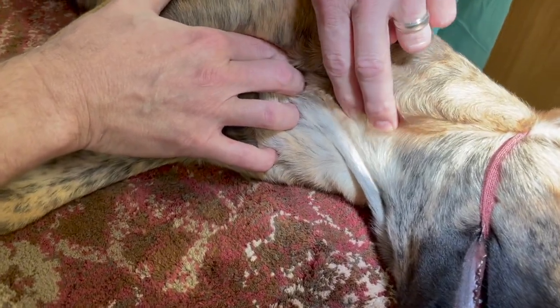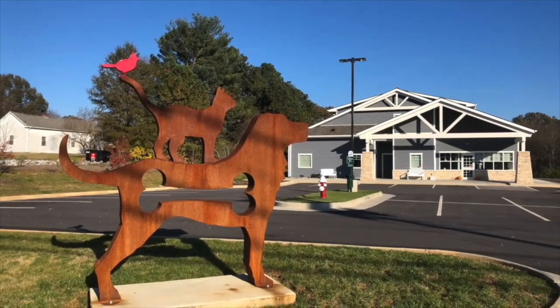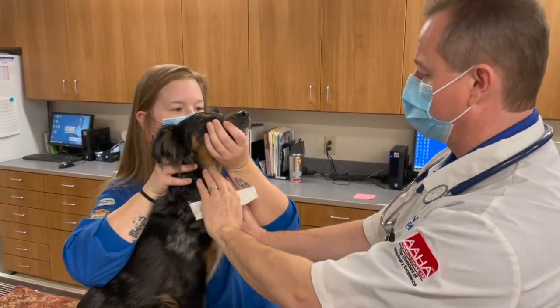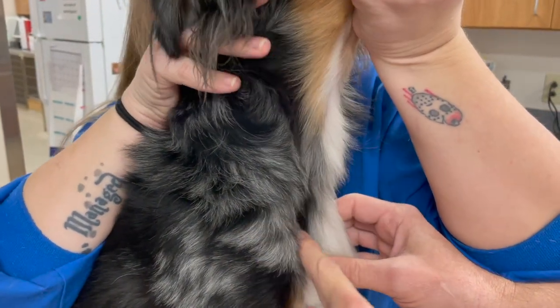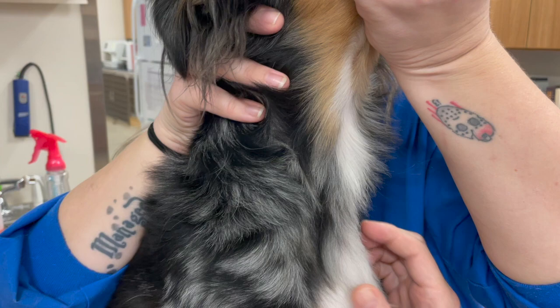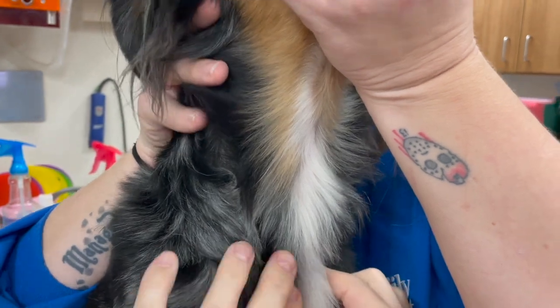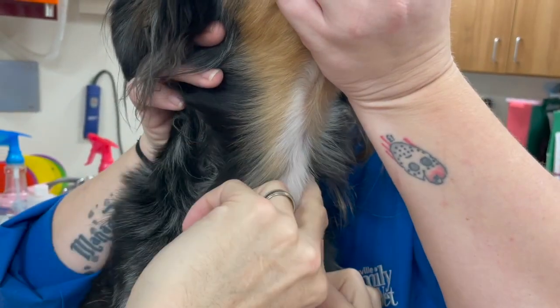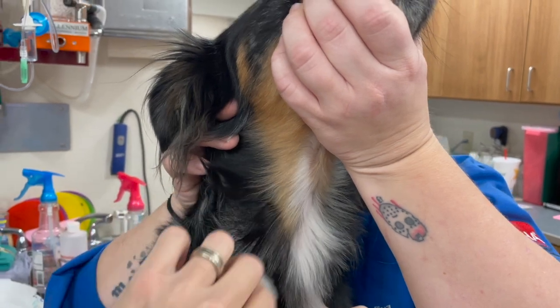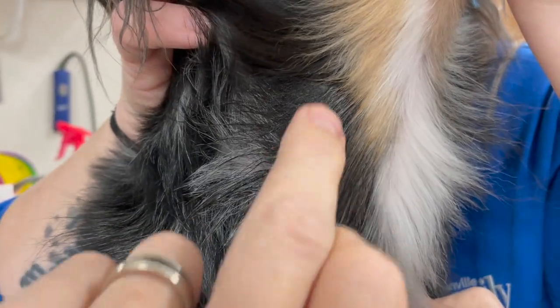We're going to take blood from Newt's jugular vein. The jugular vein runs in the jugular furrow between these two muscles here, and a lot of times it's right underneath this cowlick. If we close off at the thoracic inlet right here, you can see when you let your fingers go down into this slot — I'm going to close off both thoracic inlets so the blood is backing up and filling up the veins on both sides. That helps it stand out, so we'll wet it down with a little rubbing alcohol. See if you can see it — I think you can — if I bounce that you can see that vein right there, standing up right along through there.